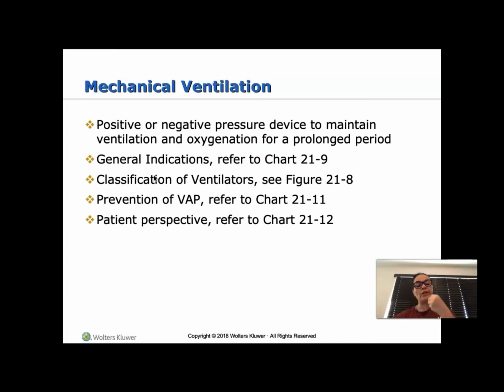Okay, so remember, we are controlling everything. The depth of every breath. So how many respirations a minute a patient's going to have, okay? How big an inspiration the patient needs. How big of an expiration the patient needs. All right. If CO2 is the problem, we now need more pressure to excrete the CO2. If oxygenation and perfusion, we need more pressure to move that oxygen through. Okay.